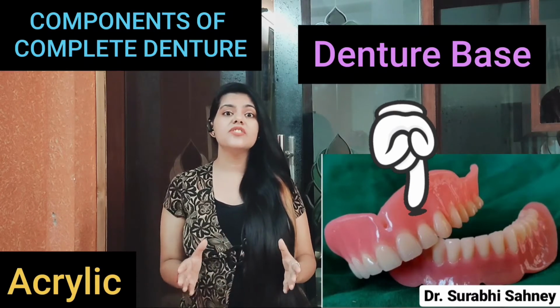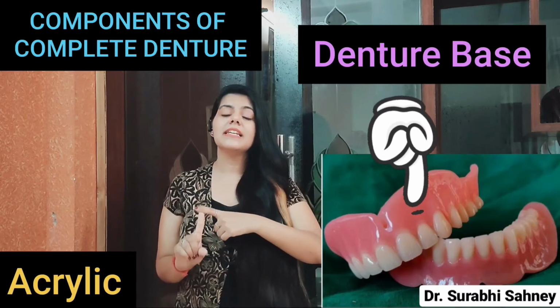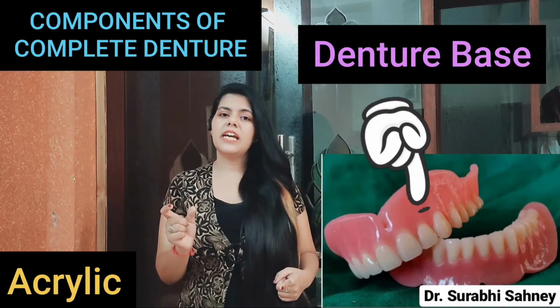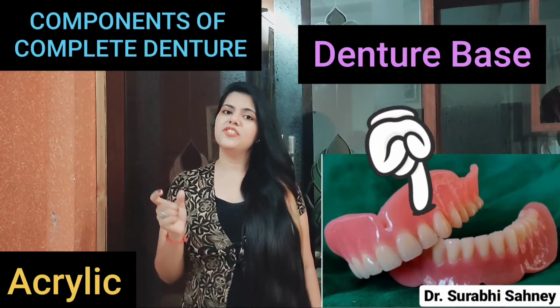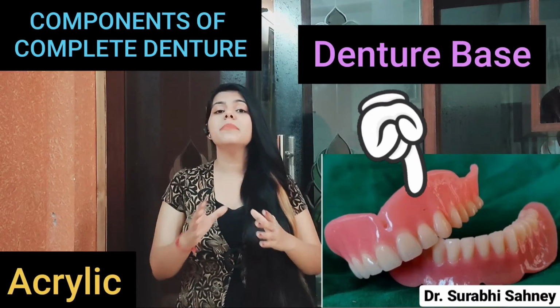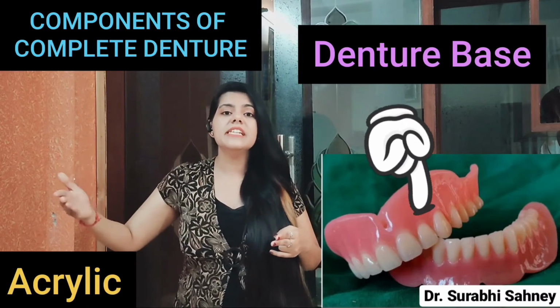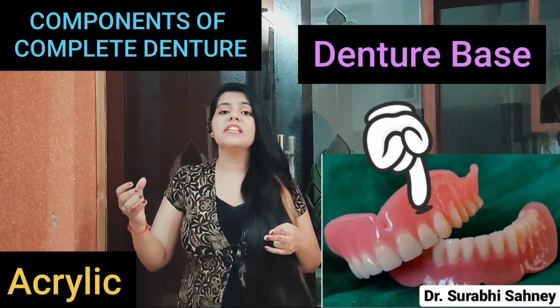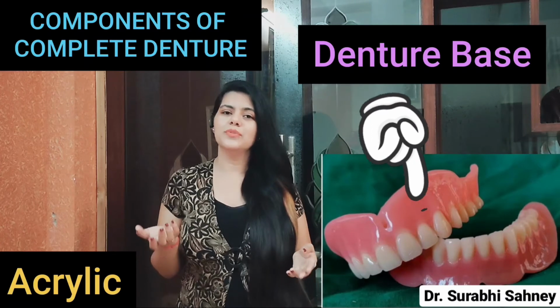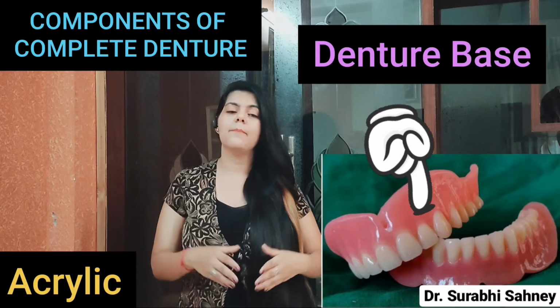Now the disadvantages of the acrylic denture base. Its first disadvantage is that it cannot be used in a very short area or tiny area as the metal denture base can be used, and that's why it affects the speech of the patient. The second thing is that it does not transmit the heat. That's why it results in the reduction of the patient's perception regarding the temperature of the food. The third disadvantage is that it is very difficult to maintain.